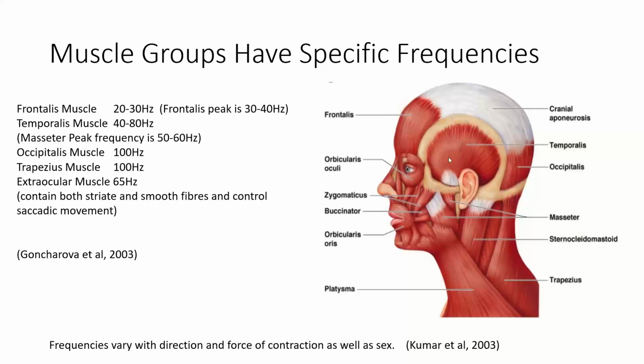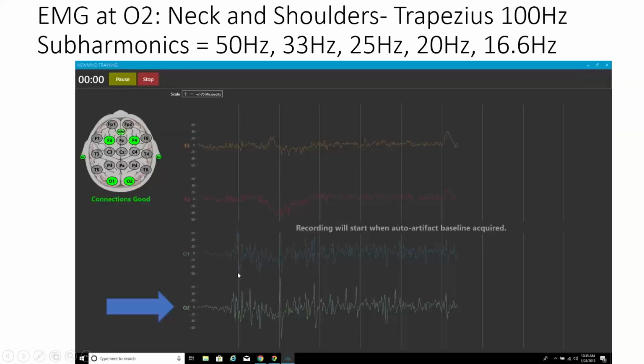And so electrical activities move across these muscle areas, but also these muscles all tend to co-contract to some degree, and they do it differently in each person, and based on scalp size and history and all these other things. So it's not too easy to isolate, but you get a pretty good idea. Yeah, the stronger the contractions, the more you can oftentimes localize them.